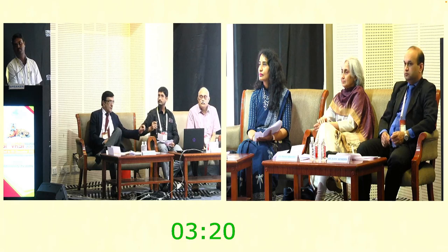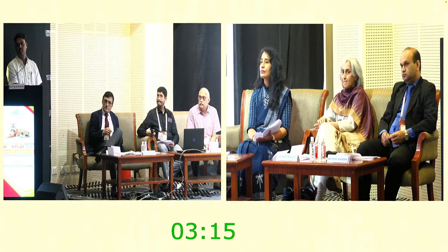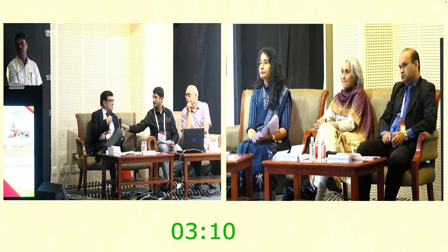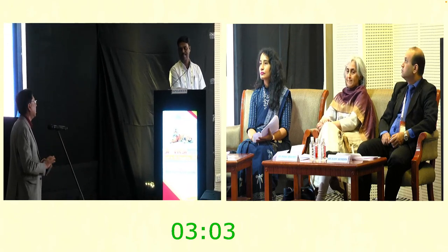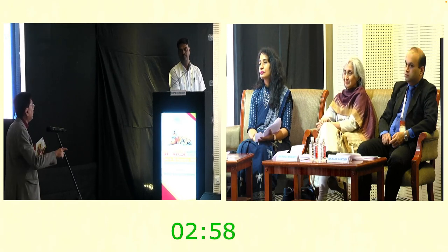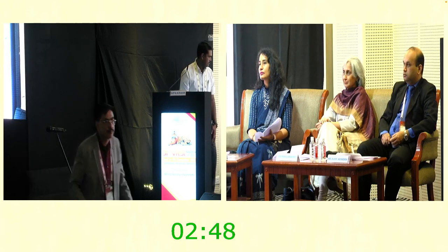So, Madhu, can I ask a quick question? Sure, sure. Thank you. Another take home message in this case is wonderful. Whatever you inject inside the eye, be it triamcinolone or PFCL, because we have seen studies of scleral rupture, I always use a vent in the other hand, because of the fear of the double bore cannula getting blocked in these situations. Totally. So you must make it a routine: anything we are injecting inside the eye, there should be a vent in the other. Point well taken, sir. Rajesh, how many cases have you used it in, apart from this experience?